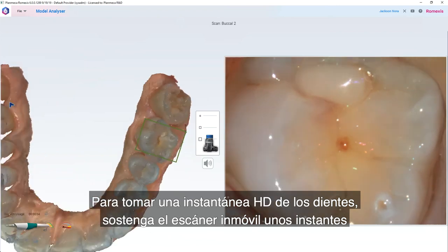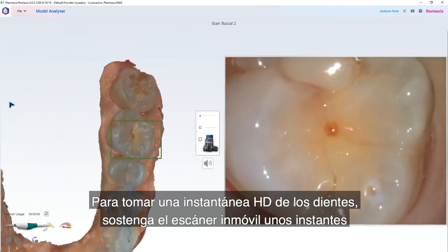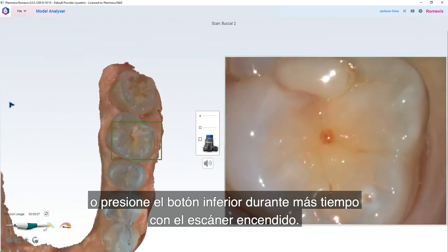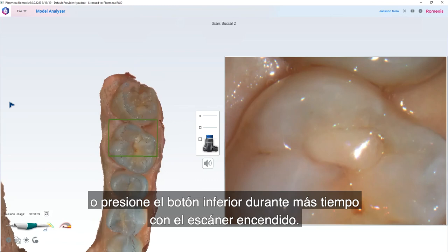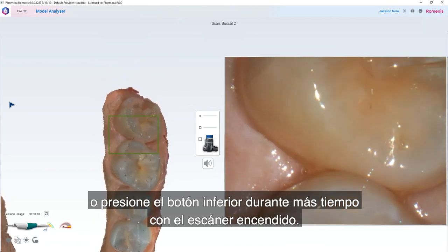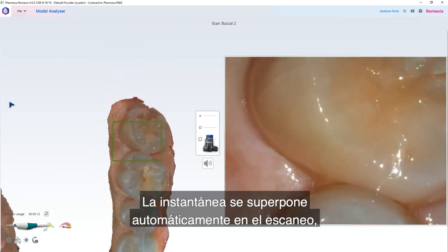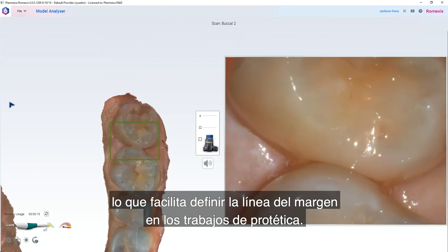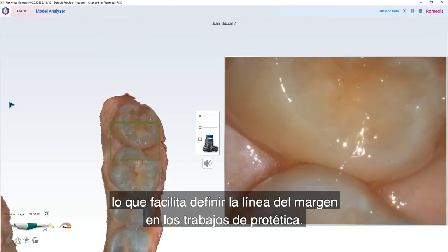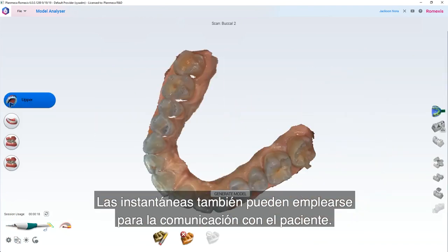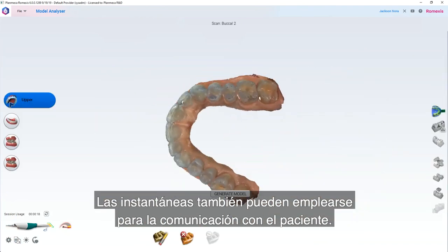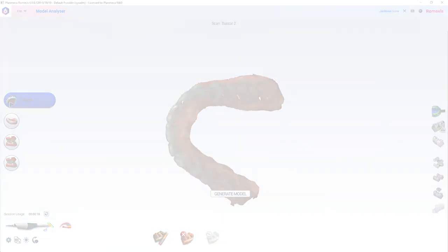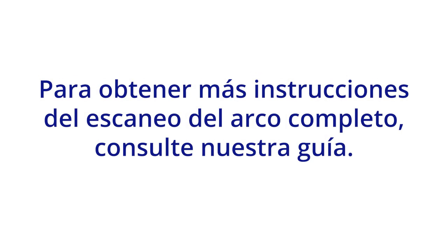Take an HD snapshot of the teeth by holding the scanner still for a while or by pressing the lower button longer while the scanner is on. The snapshot is automatically superimposed onto the scan, making it easy to define the margin line in your prosthetic works. Snapshots can also be used in patient communication. For more detailed instructions, see our guide for full arch scanning.